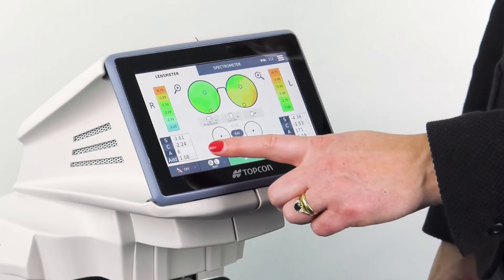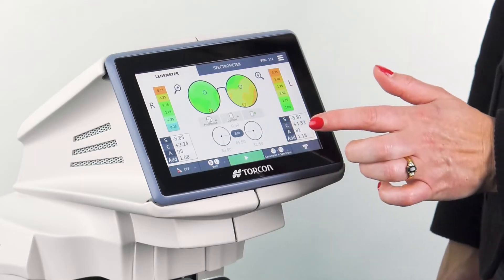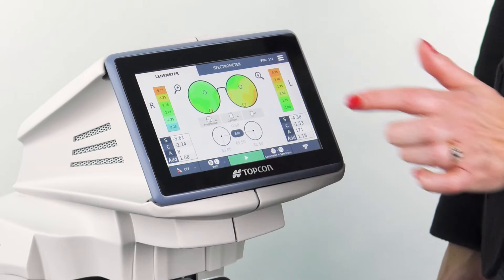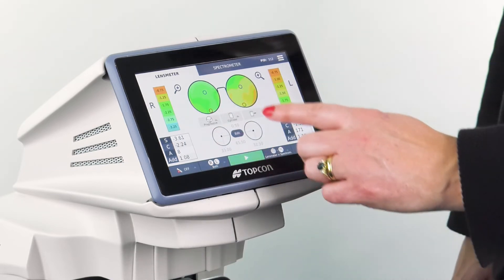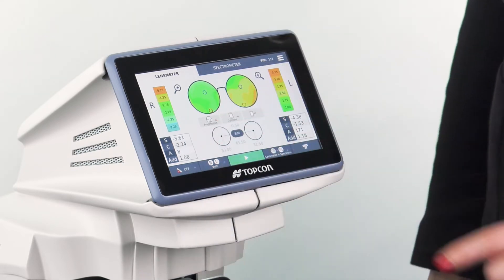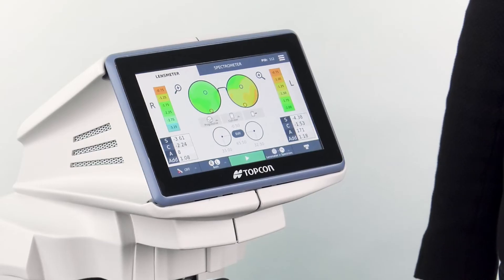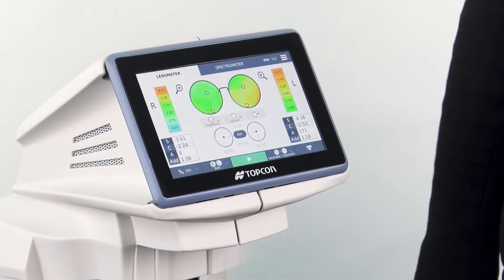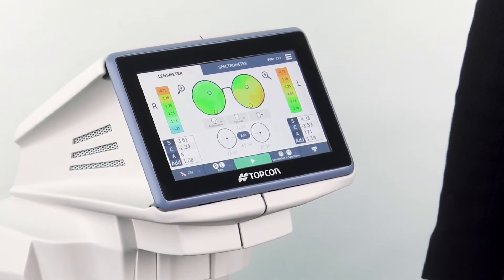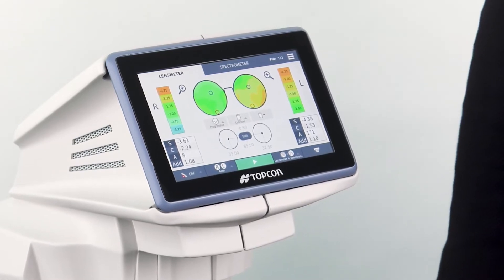The power of each lens is shown here with the sphere, cylinder, axis and add stated. I can choose if I want this information in negative or positive cylinder, and in the centre you'll find information about the lens centration and the separation of the optical centres, which in this case is 65.5 mm. The monocular distances are also given.